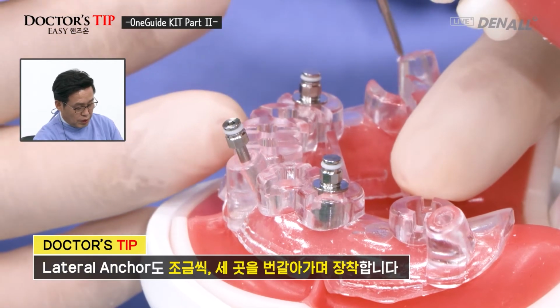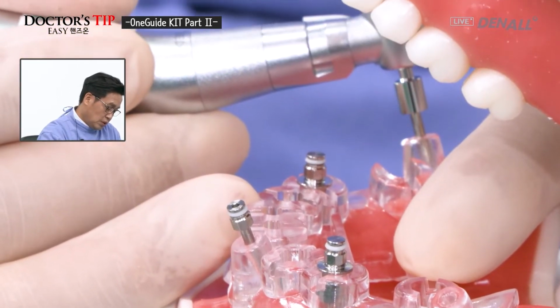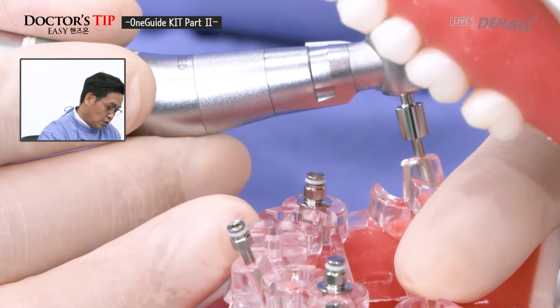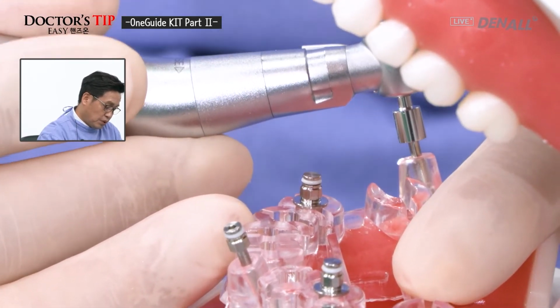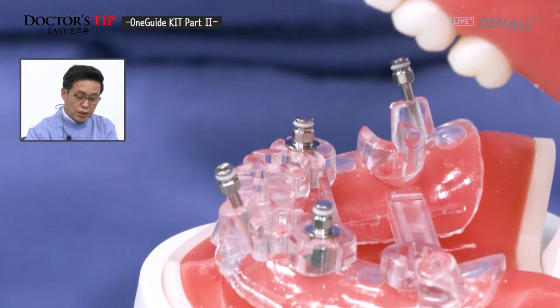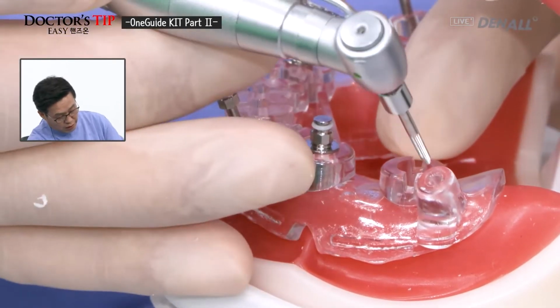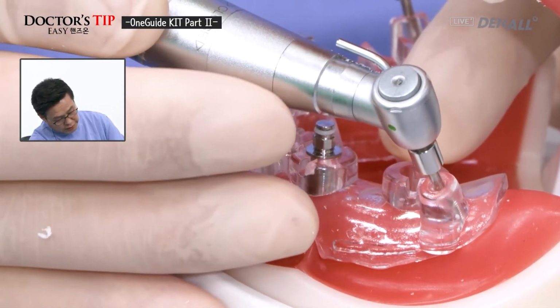I'm going to connect number 40 first. This is the same. You don't connect the anchor fully. About 80% should be enough, and the final anchor screw is removed. So posterior to number 30, anchor is going to be connected.